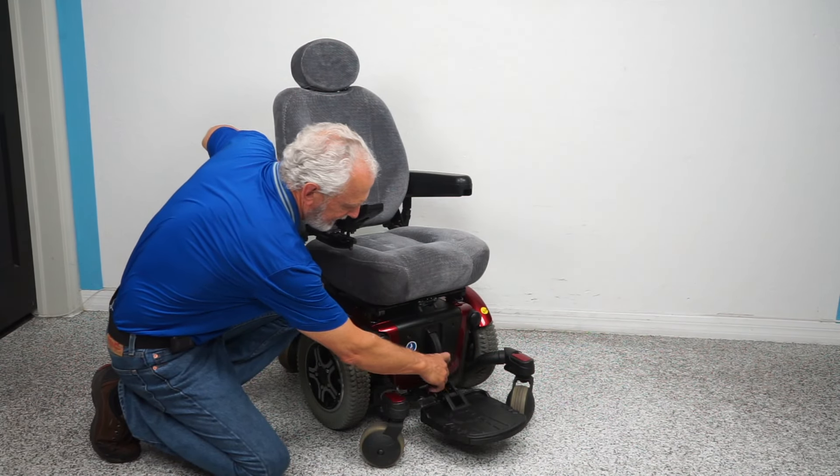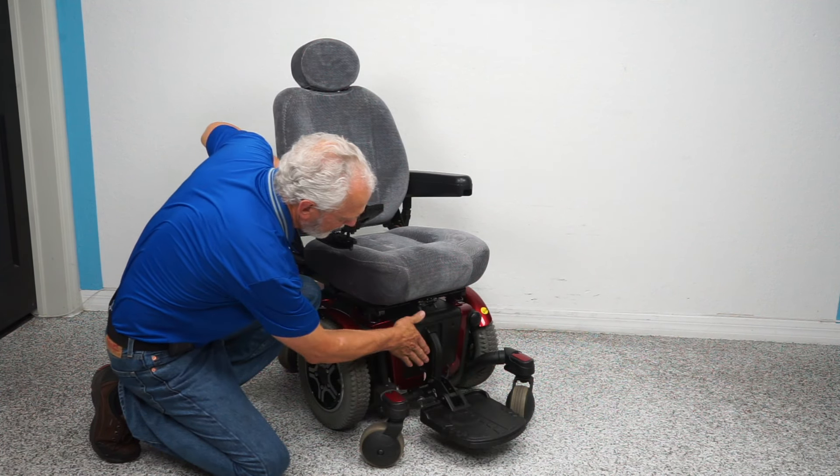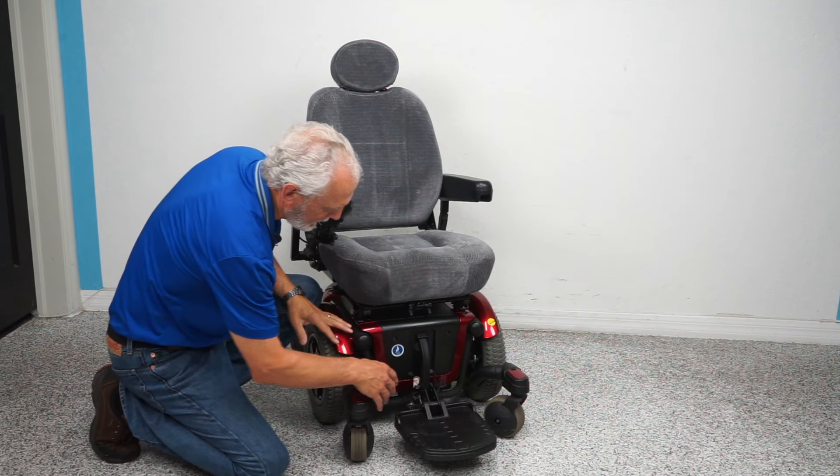The foot plate on the chair does flip up for exit. It can also be moved back — it's up two inches — but if you moved it back, you'd be sitting right here instead of right here. The batteries are right here on the chair.